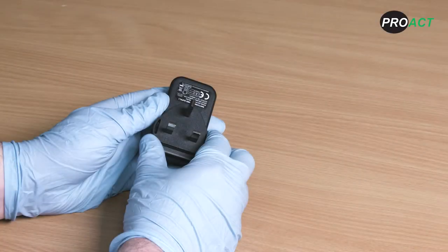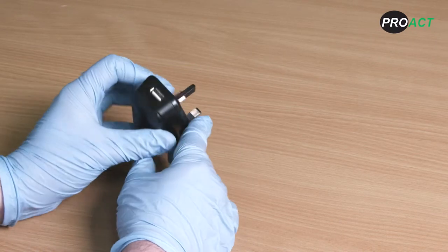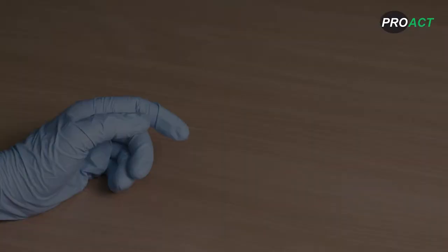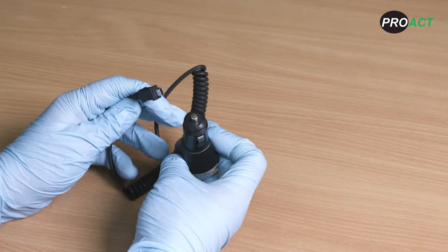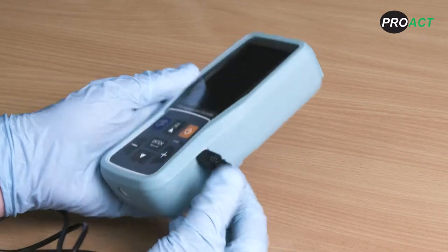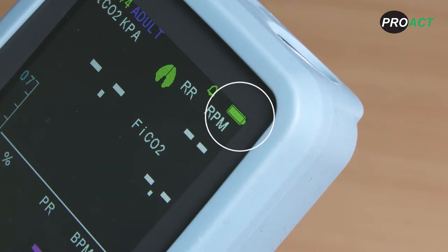Before using your PC900B for the first time you will need to ensure the rechargeable lithium-ion battery is fully charged. The PC900B comes with a variety of charging options such as a UK or European type mains charger with USB cable, and an optional 12VDC vehicle charger available to purchase additionally. Simply plug the charging cable into the mini USB port and charge until the battery level indicator is at full capacity. It takes approximately 4 hours to charge and once fully charged will operate for approximately 10 hours continuously using both capnography and pulse oximetry.